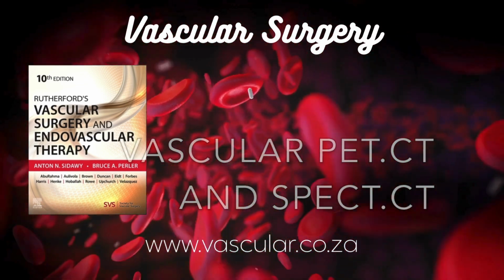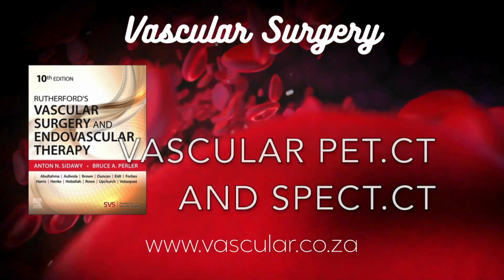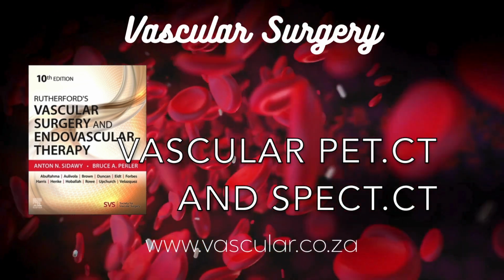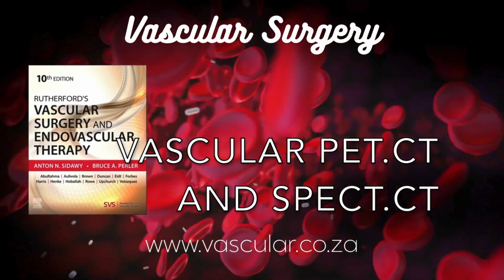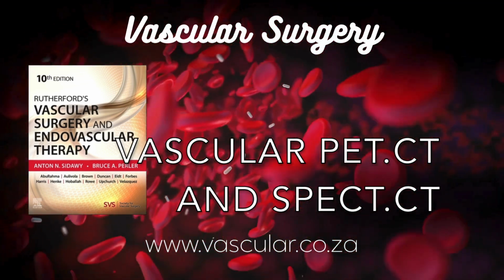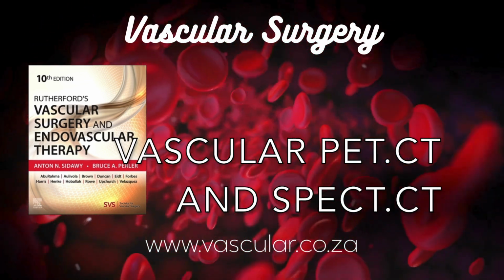Now, imaging these plaques isn't always easy, right? What are the challenges? Definitely challenges. Plaques can be small, really pushing the limits of the scanner's resolution. Some arteries, like coronaries, are deep inside the body and they move constantly with heartbeat and breathing. Motion artifact must be a problem. It is, especially for coronaries. It requires sophisticated techniques to manage.